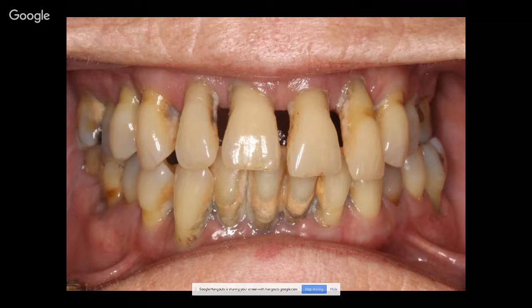The maxillary bone was insufficient. All implants did torque out, but the bone was very soft. So we elected to not immediately load the upper, and the final reconstruction for the upper is going to be an implant supported overdenture. If she was going fixed, I think we'd have thought a little bit harder about immediate loading the upper. The lower, she is going fixed.